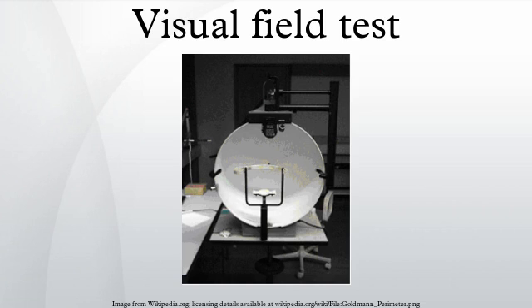A visual field test is an eye examination that can detect dysfunction in central and peripheral vision, which may be caused by various medical conditions such as glaucoma, stroke, brain tumors or other neurological deficits. Visual field testing can be performed clinically by keeping the subject's gaze fixed while presenting objects at various places within their visual field. Simple manual equipment can be used, such as in the tangent screen test or the Amsler grid.